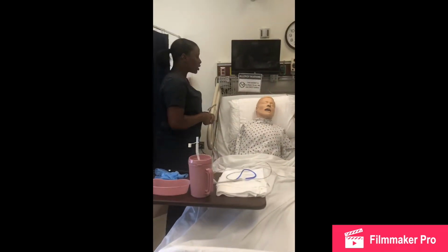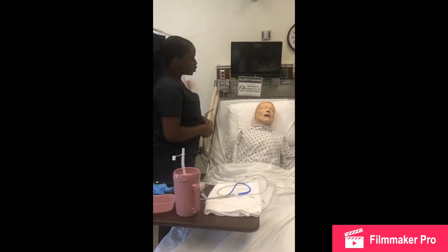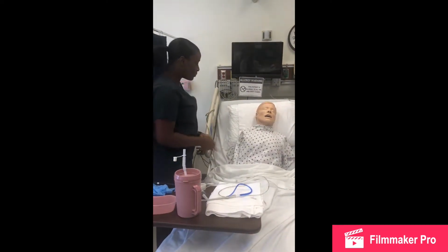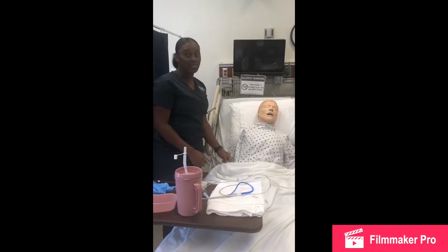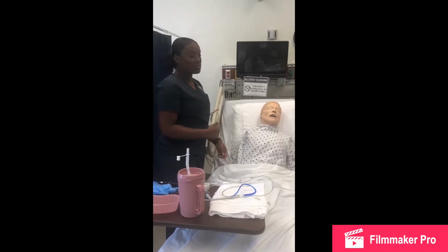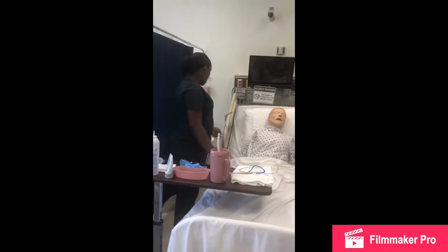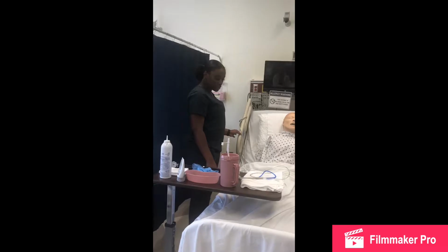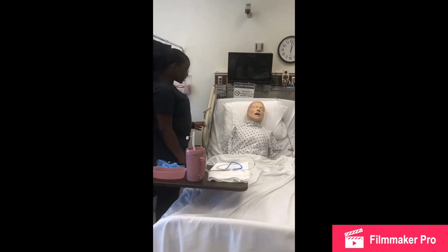Hi, my name is Ushin Walker, your nursing student today, and I will be here to do a NG tube insertion. Can I have your name? I will check the patient's armband to make sure the name and date of birth correspond with what I have, and make sure that the patient verbalizes that to me as well. So I will set my patient in the correct position, making sure he's in a high Fowler's position.